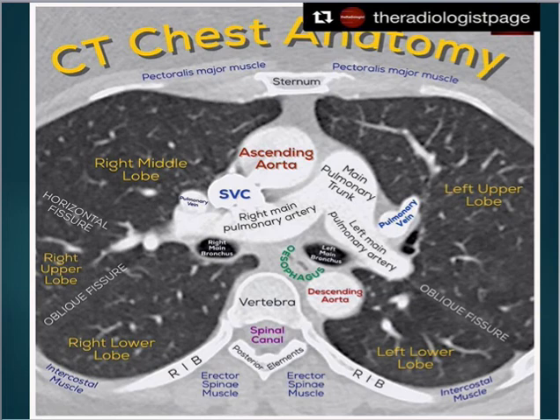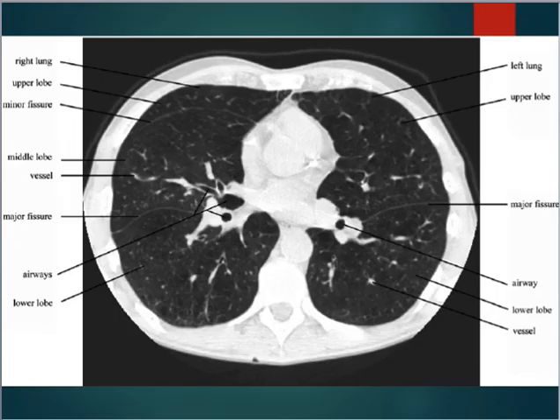This is a labeled image of a chest CT. So remember, black is air. Anytime you see an image like this that would be black on both sides, where you wouldn't be able to see many organs, you need to assume that that's a chest CT. Again, we're looking at that patient from the feet up, in anatomical position. So this is the right side, and this is the left side. You can see the ribs out here, you can see the vertebrae here, spinal column, descending aorta, here's the esophagus. The sternum out here, some of the ribs and the chest muscles. I'm not going to go through and talk about everything that's labeled here.